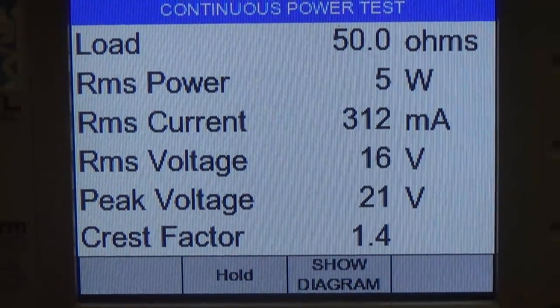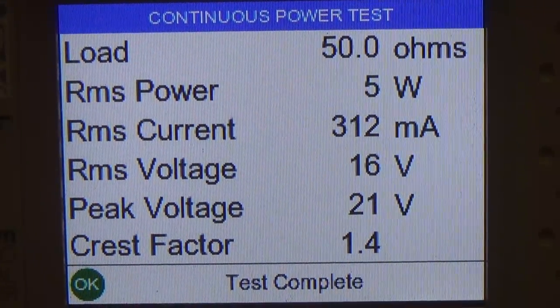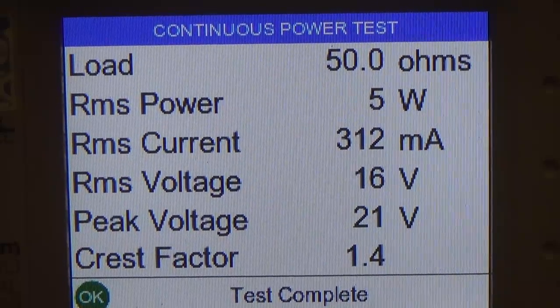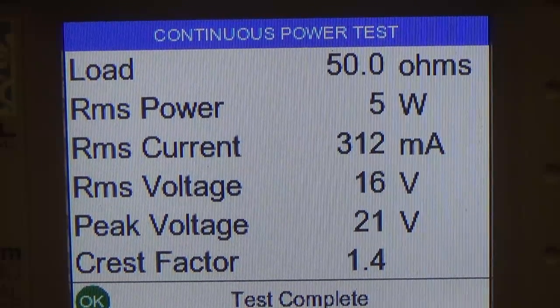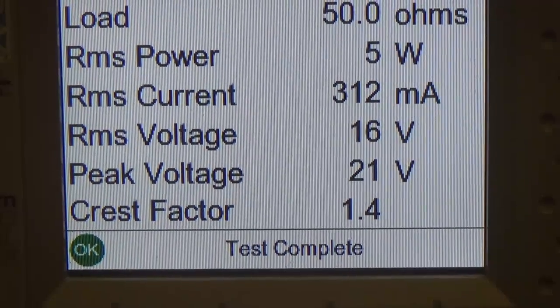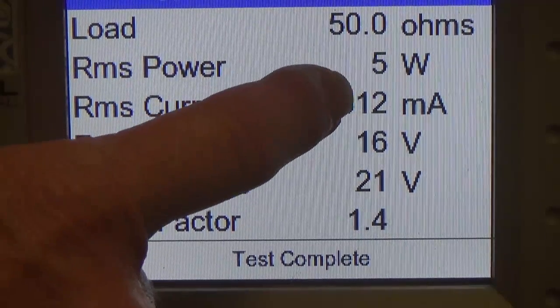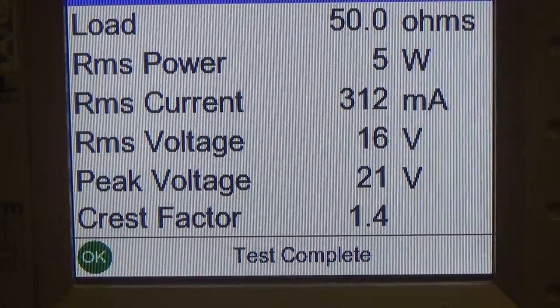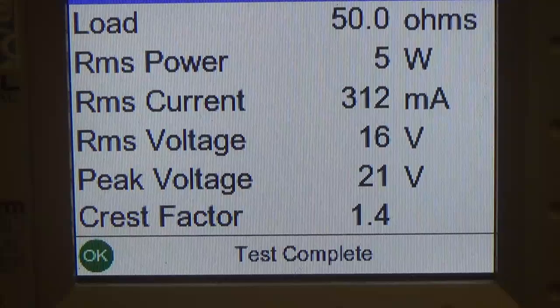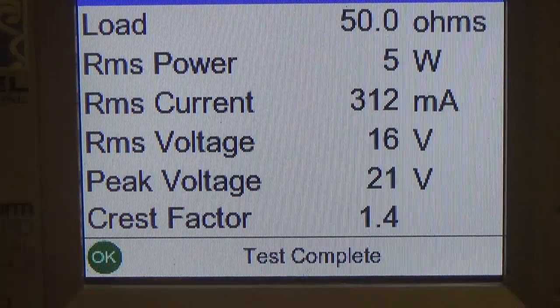You hear the Ligasure firing, and you look at the measurements. As soon as test complete comes on, you press stop RF. You hear the low tone go away, and now it's important that you record the current. Always remember that 312 is what you want to know. The manufacturer, when you're performing this PM, is not interested in what the wattage was, it's interested in what the current was.